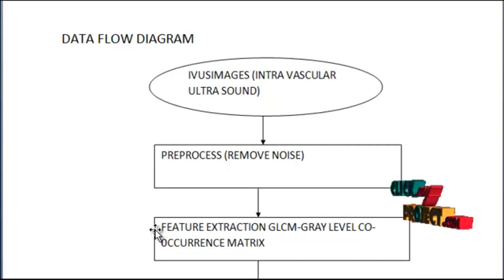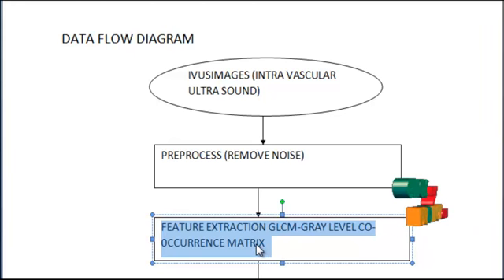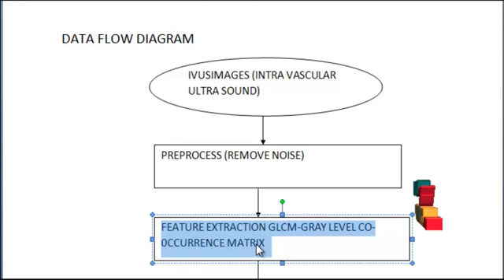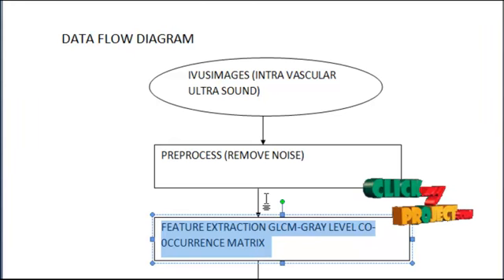The next one is feature extraction using GLCM, gray level co-occurrence matrix, or associated texture feature calculations or image analysis techniques. Given an image composed of pixels each with an intensity, the GLCM is a tabulation of how often different combinations of gray levels co-occur in an image or image section. Texture feature calculation uses the contents of the GLCM to give you a measure of the variation in intensity at the pixel of interest. The virtual variable is created in the following way on the GLCM texture page of the variable properties. The next one is classification.